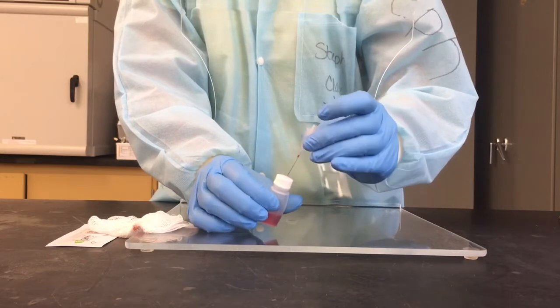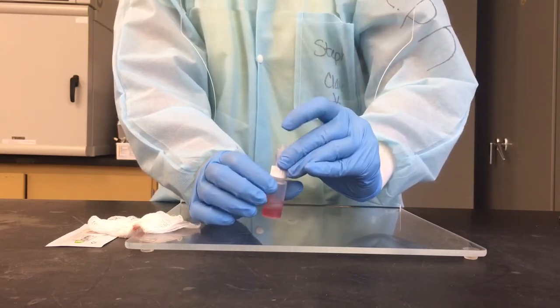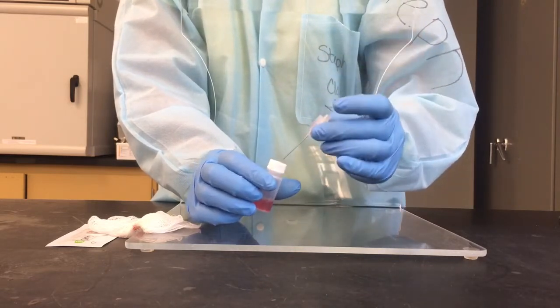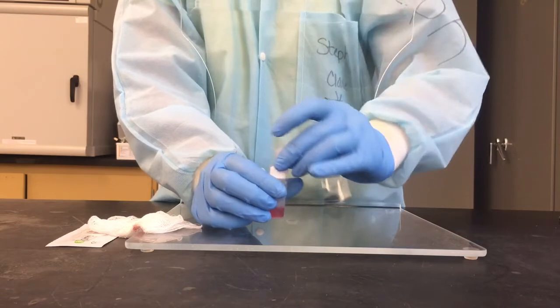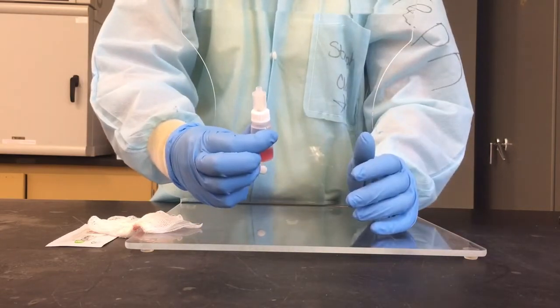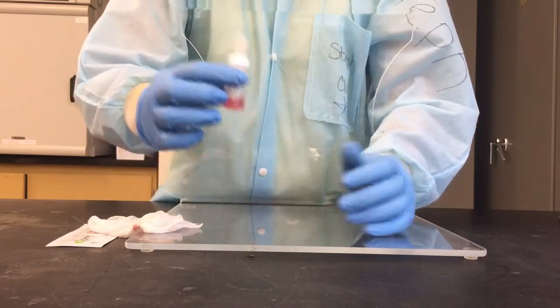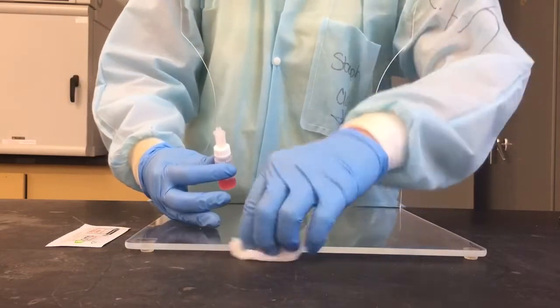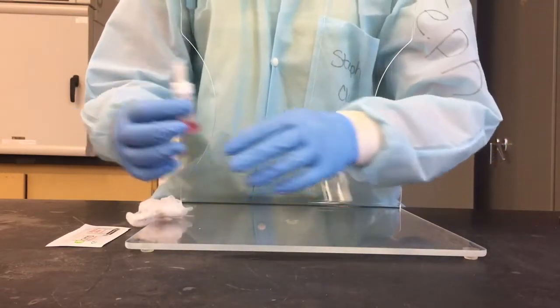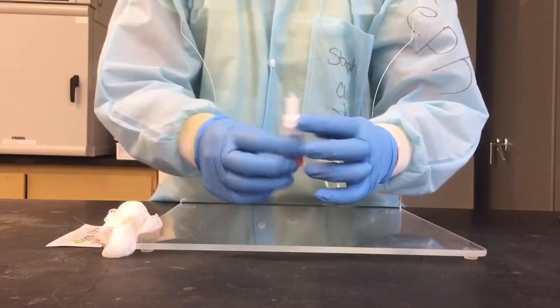Once this looks pretty clear, so once you've done this probably 3, maybe 4 times, and it looks pretty clear coming out of here, then you probably are pretty well mixed. You can also leave your reservoir in here and sort of pipette up and down very, very gently to get them mixed, but don't do what I just did and squirt it out the top. If you do squirt out the top, it's okay. You'll be behind your shields anyway, but make sure that you bleach down your shields and your stations after.